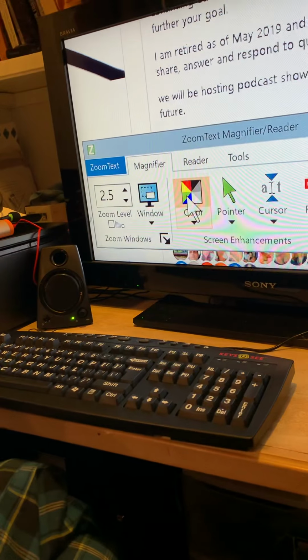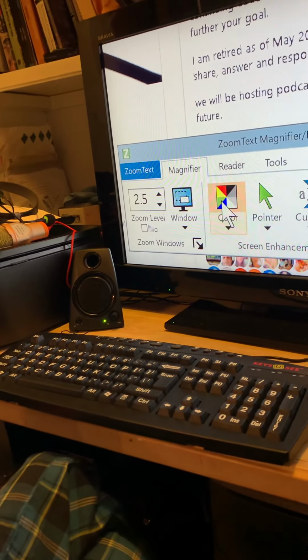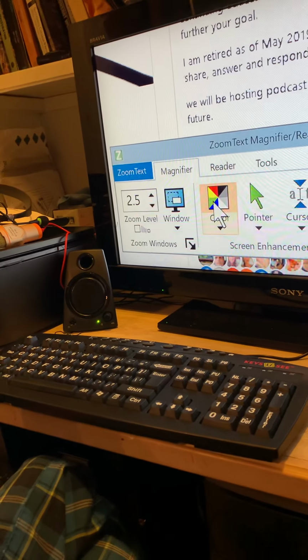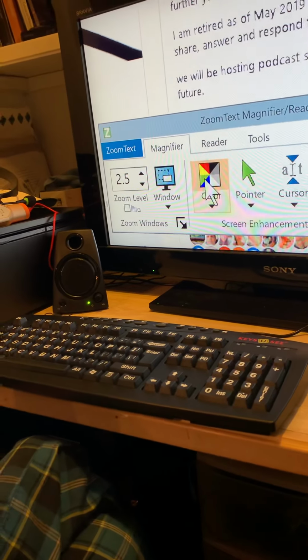I thought C was for copy. It is when you hit control. That's a Windows function, right? Yeah. So it's the same concept, really. I've got to use the letter that matches the thing that I'm doing, right? Very good, though. That was excellent.